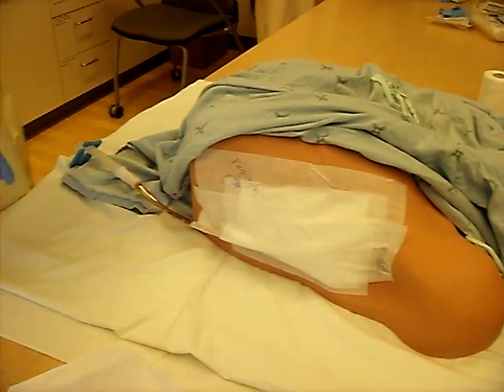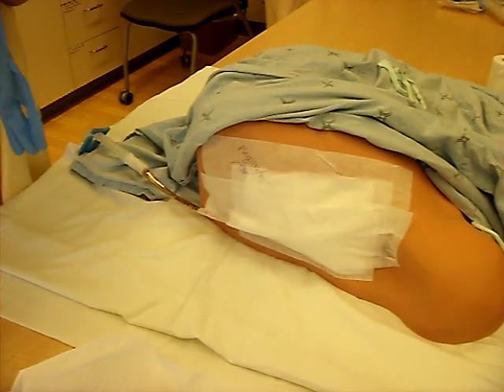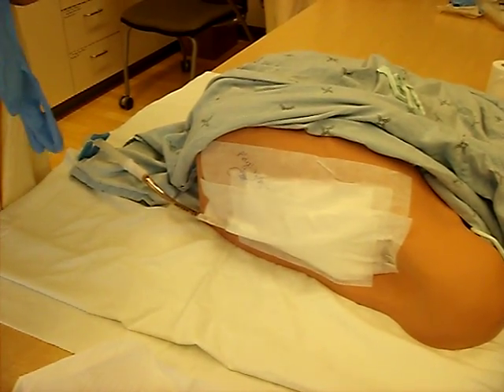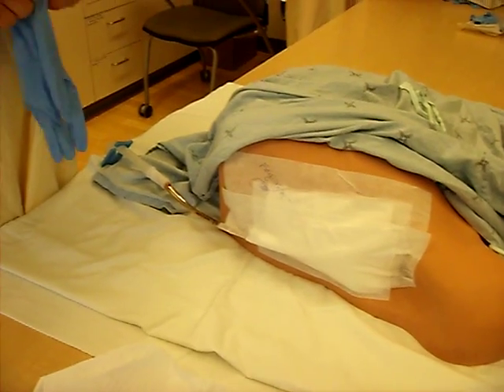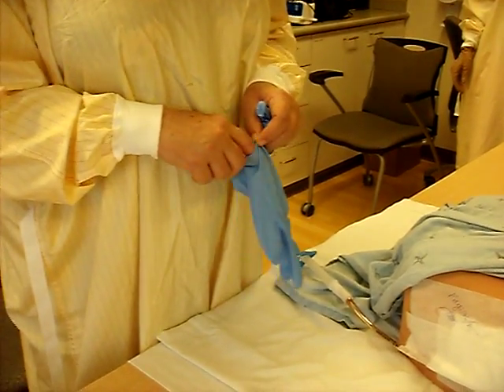Generally, we'll coach the patient to take 3 large breaths in and out, and on the third one, big breath in and hold it, hold it, hold it, and pull the tube, or hold it and hum out if the patient's unable to sustain that.